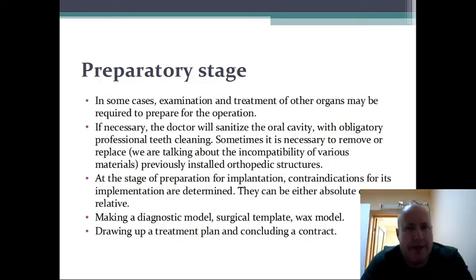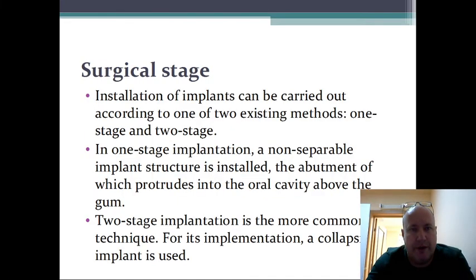Then in some cases, examination and treatment of other organs might be required to prepare for the operation. And you might also need to make a correction in these organs. If necessary, the doctor will sanitize the oral cavity with obligatory professional teeth cleaning. At the stage of preparation for implantation, contraindications for its implementation are determined. Making a diagnostic model, surgical template and wax model, drawing up the treatment plan and concluding a contract.